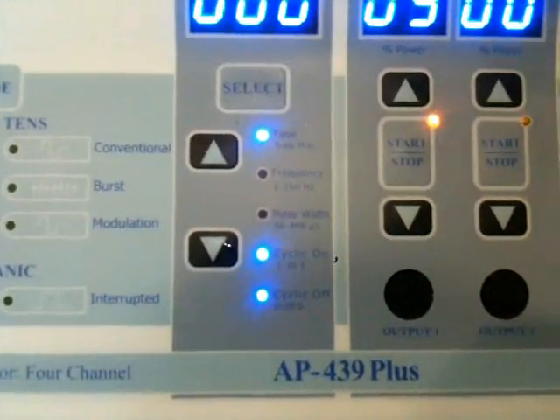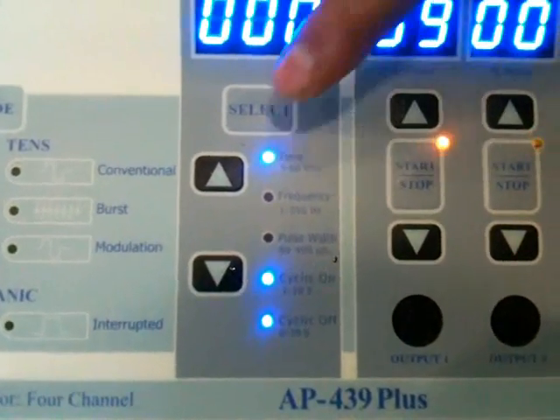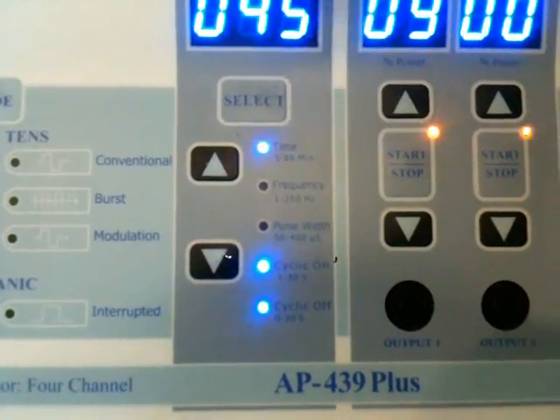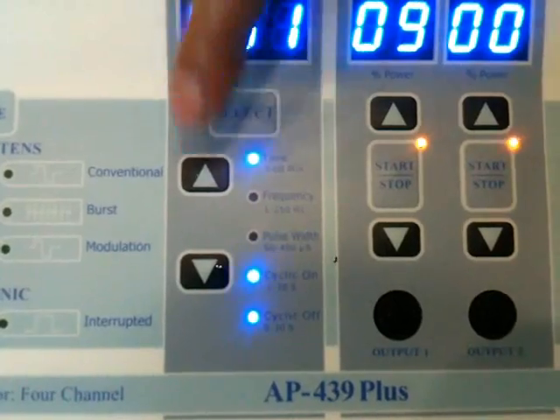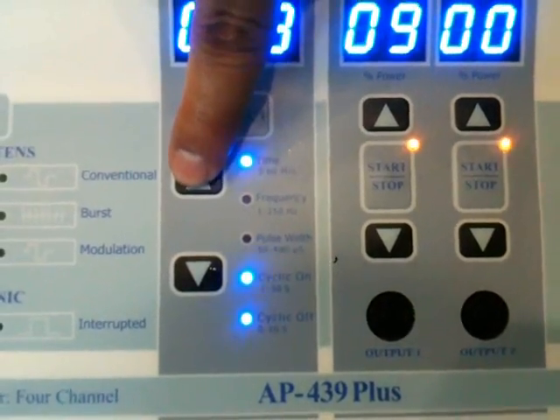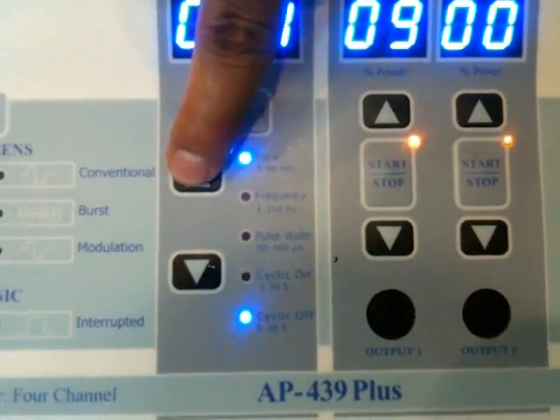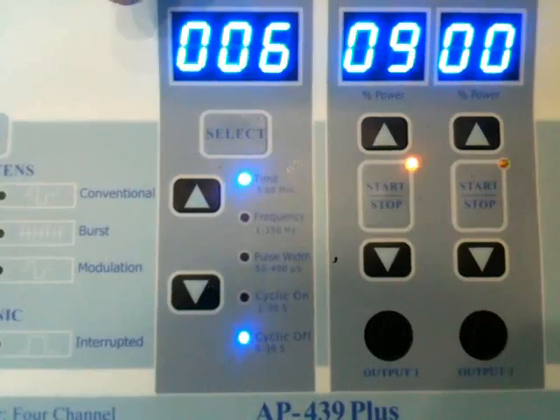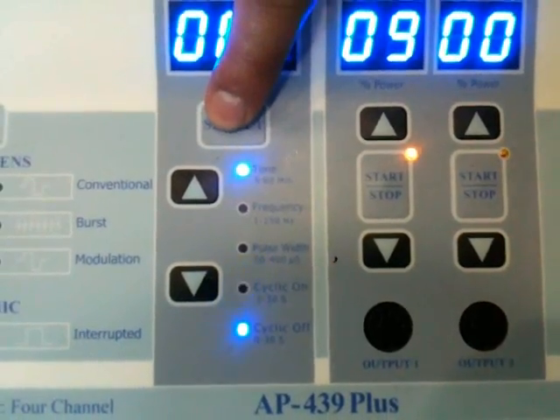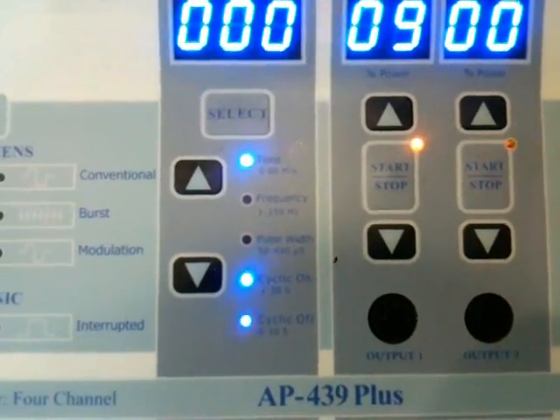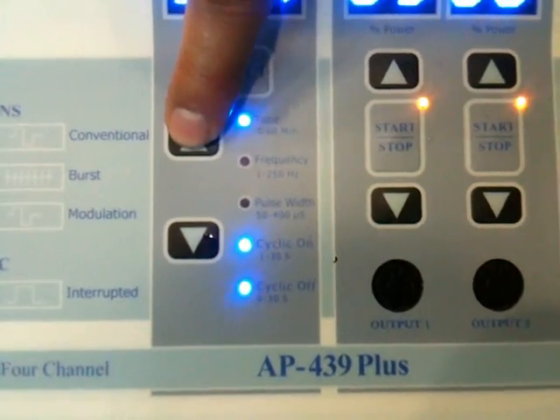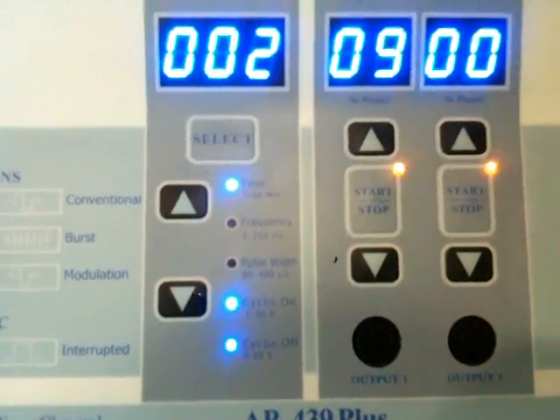Here are the selection parameters. Time is fixed as we set in the first channel — time will be common for both channels. Now it's cyclic off. You can rise.